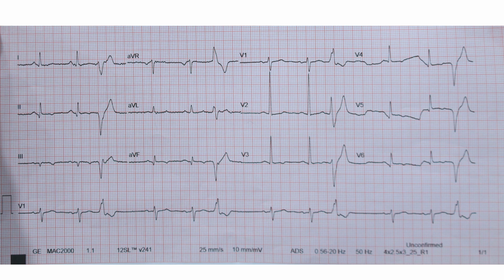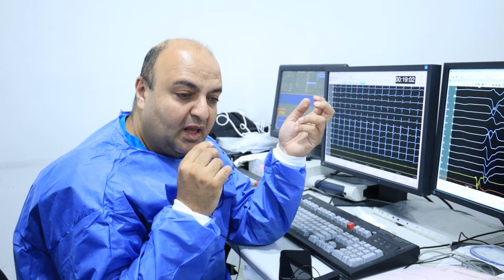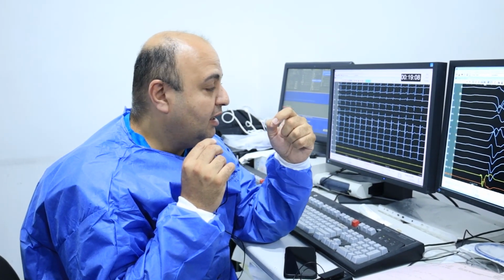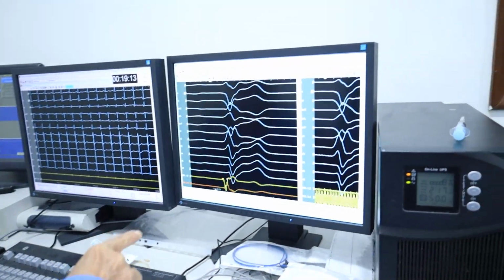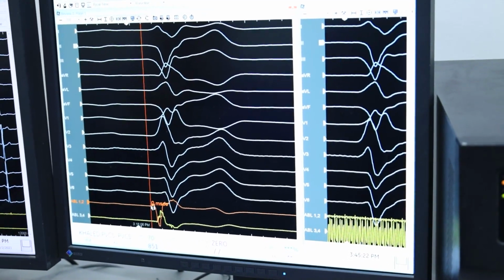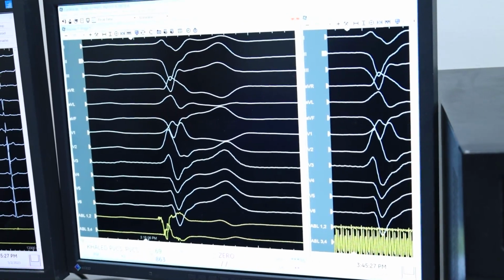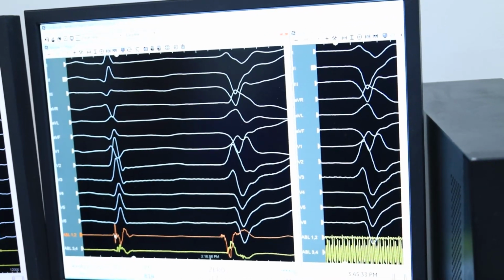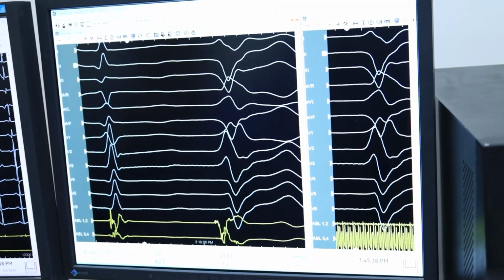papillary muscle. So when I went with the catheter inside the ventricle, I went to about 4 to 5 o'clock in LAO view, to get such a nice potential pre-QRS complex during the PVCs, as we can see, about 34 millisecond, and inside during sinus there is also this nice potential which is mostly Purkinje potential. So this is Purkinje potential PVCs.